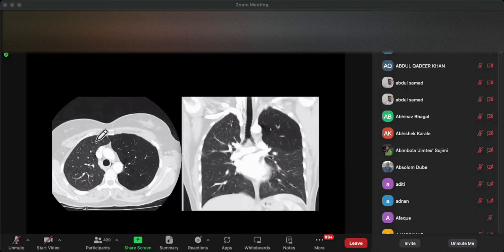And when we do the CT scan, you can see that already there's a bit of mediastinal shift over to the other side. So any small expiration will cause a mediastinal shift over to the other side. There's a paucity of blood vessels. There's a dilated bronchus, which you can see here, which is one of the features of Swyer-James or McLeod syndrome.